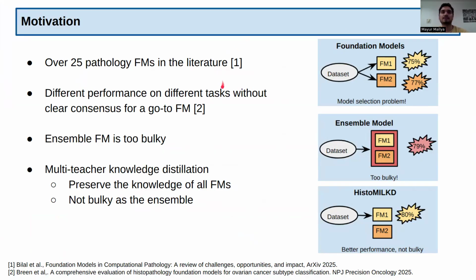In the last couple of years, there has been a surge of foundation models in digital pathology. And as of today, there's over 25 foundation models out there. And each of these foundation models, when used as a backbone for feature extraction, leads to different levels of performance on different downstream tasks. And there so far has been no clear consensus of a superior go-to foundation model.